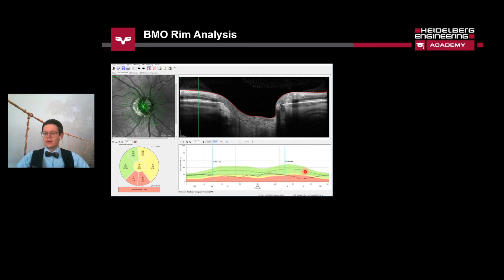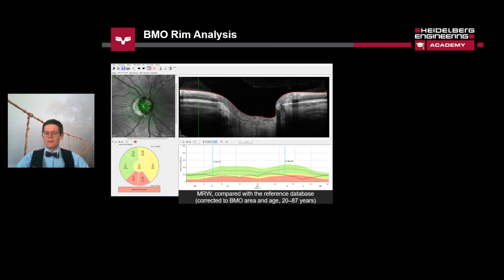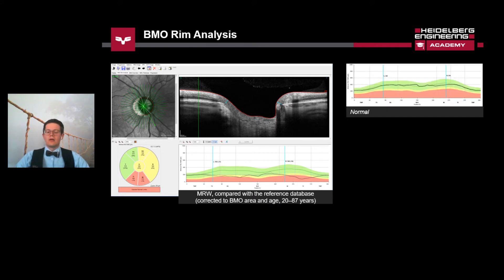We can also see the histogram on the right. The conventional way to illustrate thickness data at the optic nerve head is using a T-SNIT profile. This profile starts at the most temporal point of the disk and proceeds clockwise from temporal to superior, to nasal, to inferior, and back to temporal quadrants. This histogram shows the normal values of the BMO minimum rim width. The black line follows the mean value of the reference database — the green line — so if the black line is more or less parallel to the green line then it looks normal.